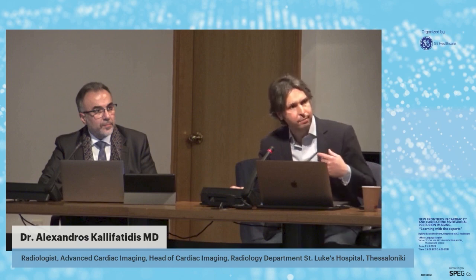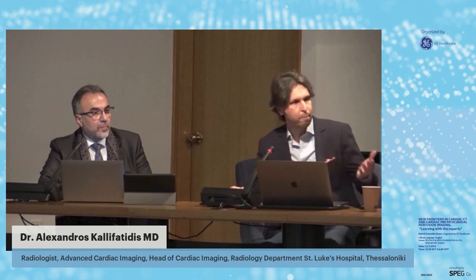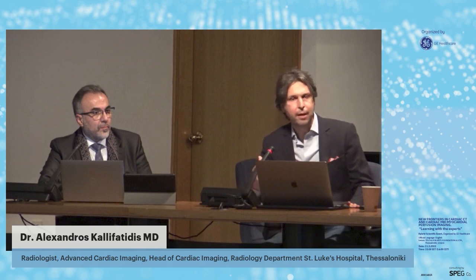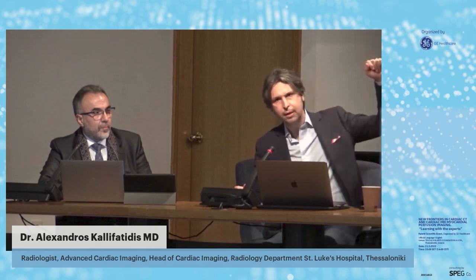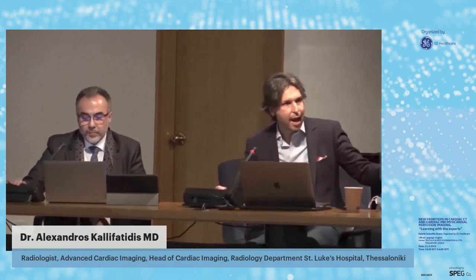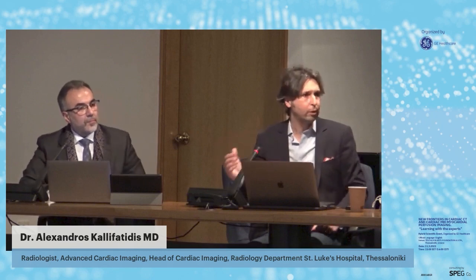Also, if we have devices, for example, not usually pacemakers but ICDs that are compatible with MRI, we proceed with the CMR examination. We can have artifacts from the parts of the ICD, but there we can also use some additional tricks. For example, we can have the patient place their hand like this, so we can leave our field of view with fewer artifacts. Other artifacts could be a wrong positioning of our slices, as I showed before, and folding artifacts.